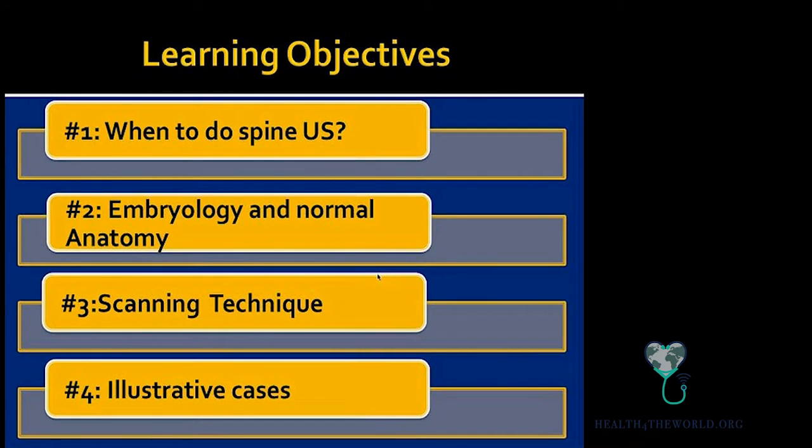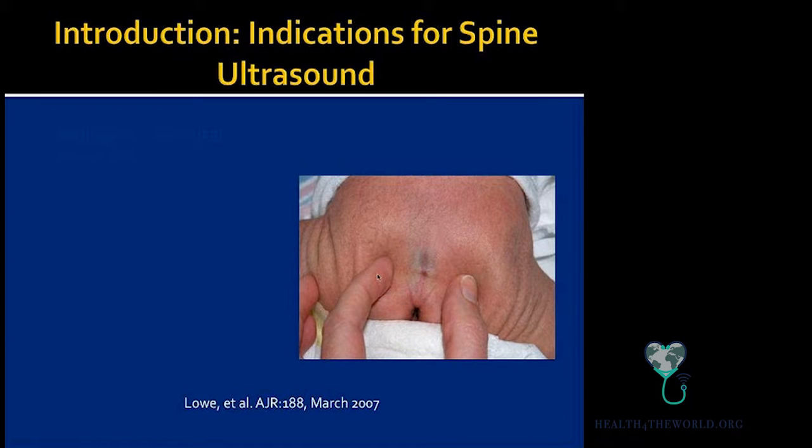All right. So when you should do spine ultrasound, we'll talk a little bit about embryology and some normal anatomy. Also talk about scanning technique and show a few illustrative cases.